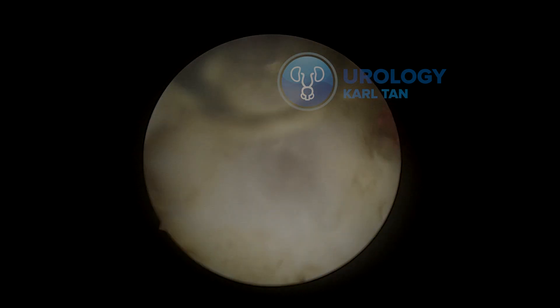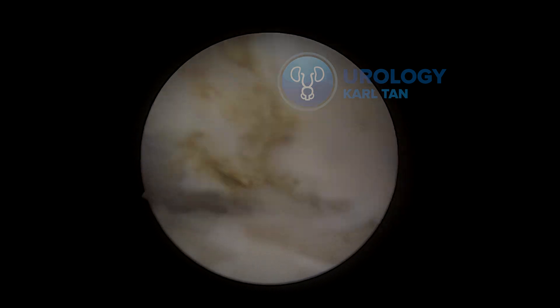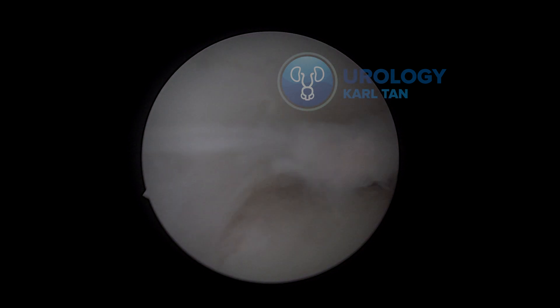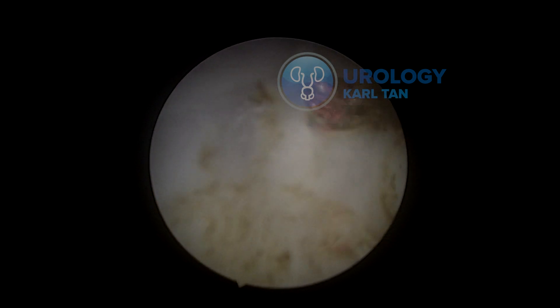I focus on cutting the gland and maybe just leaving a little behind to prevent perforation. If we don't perforate, we win — that's one thing I try to prevent. So I've been releasing the anterior part and now I'm doing my incision at 12 o'clock of the prostate.